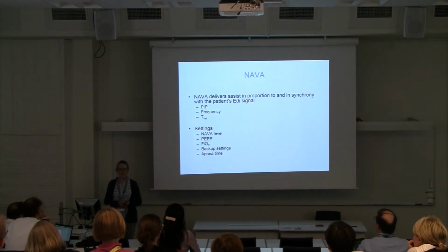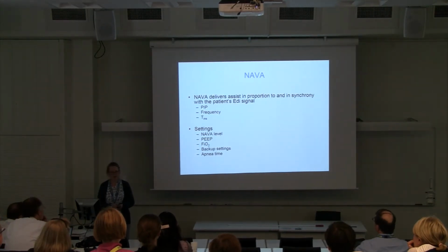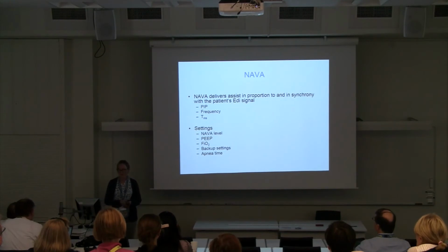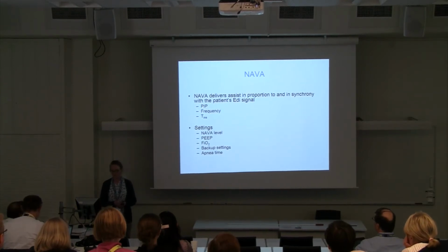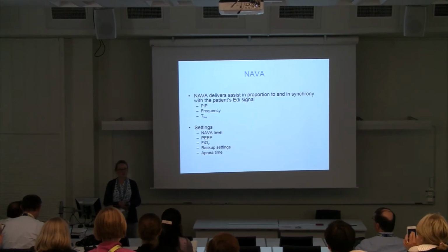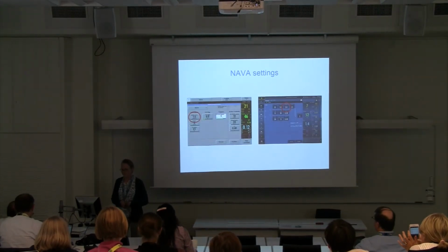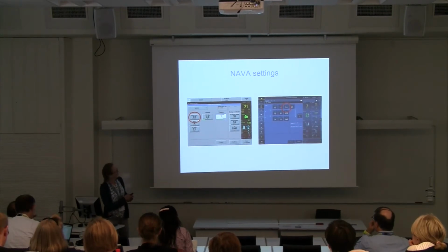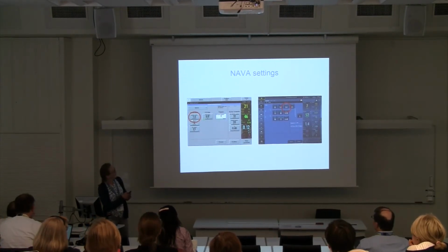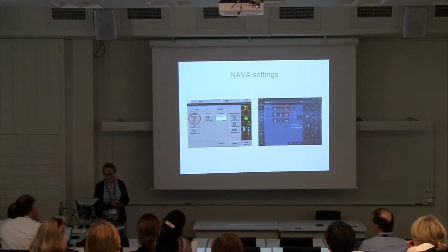So in NAVA ventilation, it is the patient that determines the peak inspiratory pressure, the respiratory rate, and inspiratory time. And what we need to set is NAVA level, PEEP, some backup settings in case of apnea, and also the apnea time. If I start with the NAVA level, here Camilla was switched to NAVA with a level of 1, and Ahmed with a level of 2.